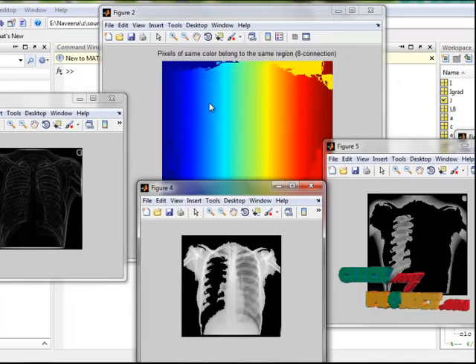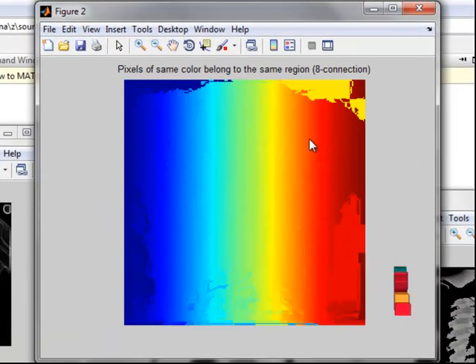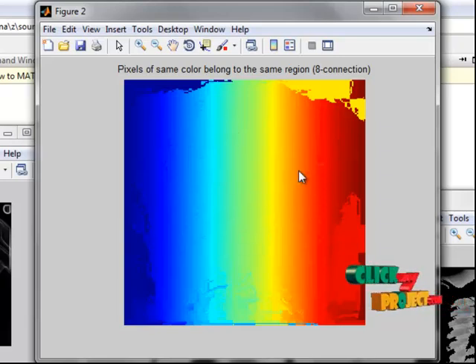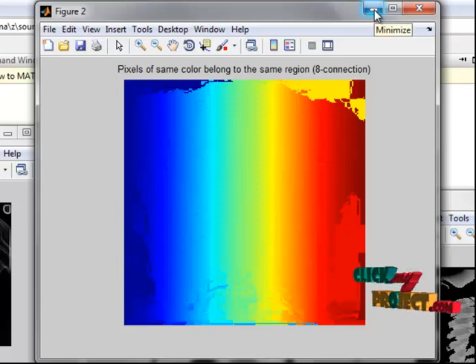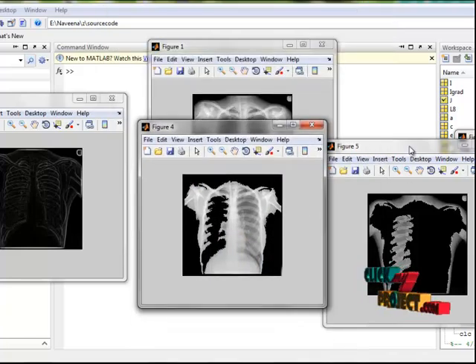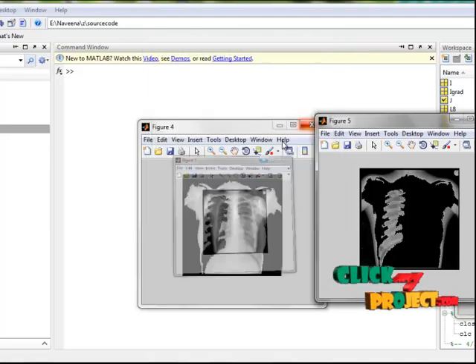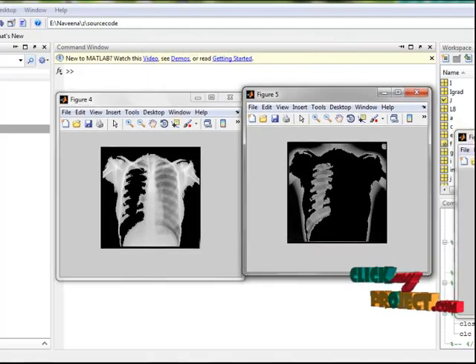This is the eight-connected neighborhood pixel image — these are the neighborhood pixels, each with color deviations. Belonging the seed point and the threshold condition, the foreground and background are separated. This is the foreground image and this is the background image.